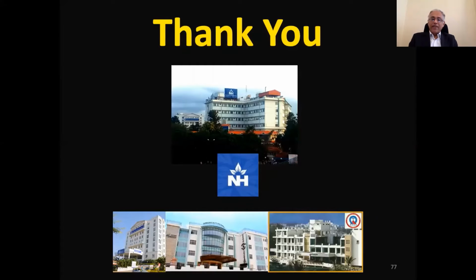We have a tendency of over-diagnosing LV non-compaction because imaging has become so good, and we are also aware of this entity, but we have to be very clear before we associate it with LV non-compaction. You have various criteria, and we need additional imaging modalities before arriving at that conclusion. If you have the facility, use contrast echo.